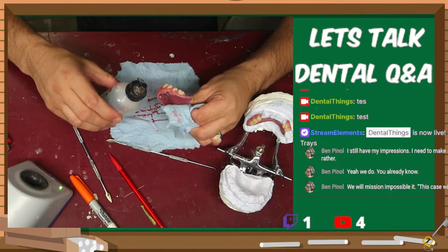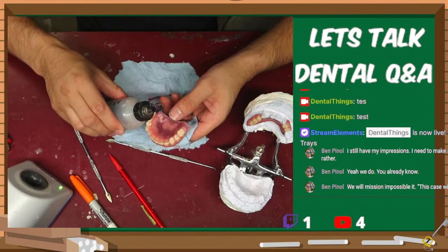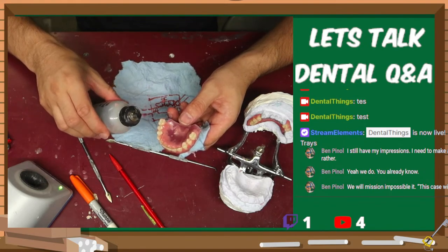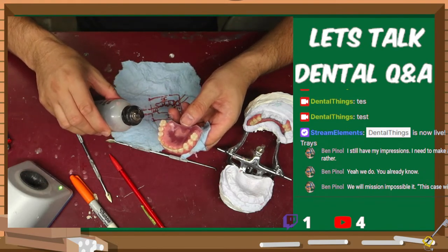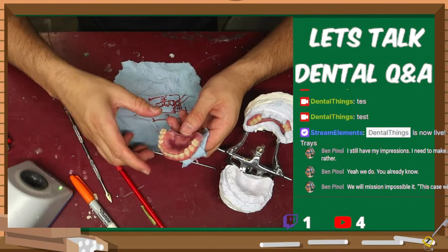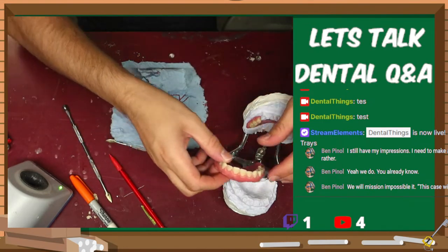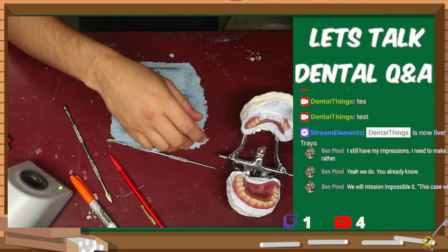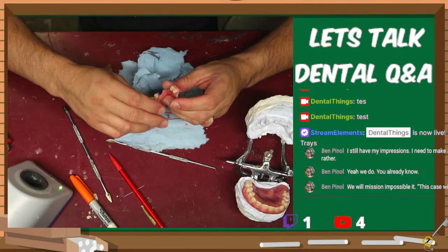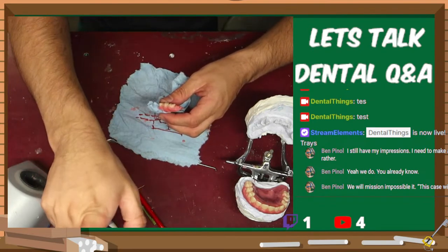All right, I think I'm done with this upper for the most part. I need to do the lingual. I'll fire up the lingual a little bit just to make it smooth. And then I can send this back for a wax try-in for the upper. So I'll put this back off to the side. I'm going to work on this lower just for a little bit. I need to fire it. That's all I need to do.